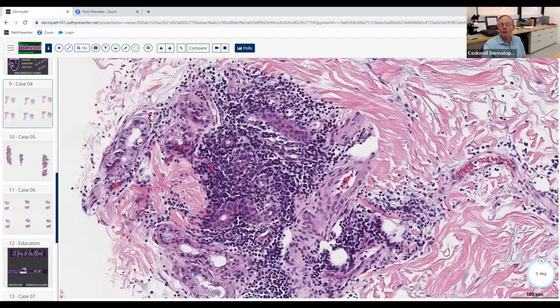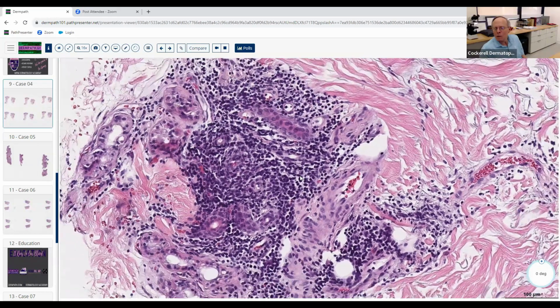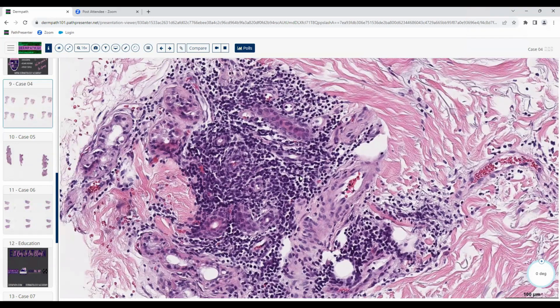I'll just go for one other. Lymphoma. Would you say lymphocytoma cutis? Is that what you said, Kieran? I said lymphoma. Yeah, some of the lymphomas can look like this also. I throw that in there too. But pseudolymphoma too. Yeah, pseudolymphoma usually is more of a nodular, wedge-shaped infiltrate with EOs, so it's not the classic pattern of this.